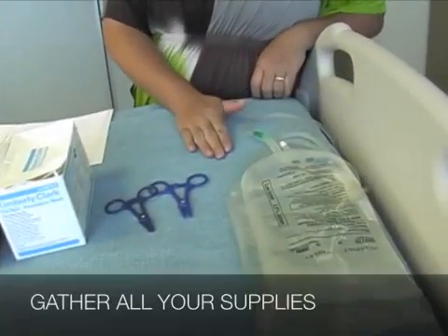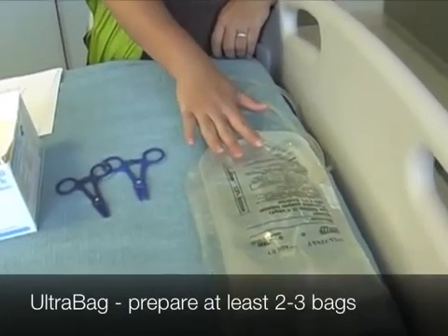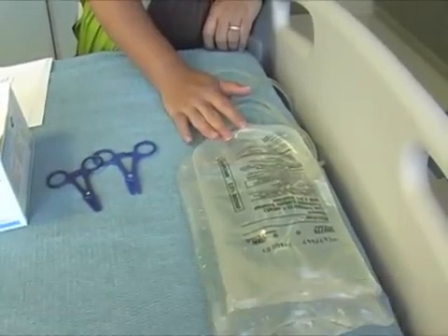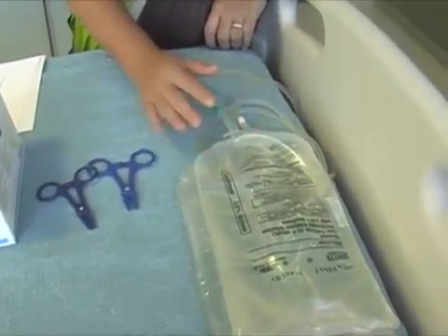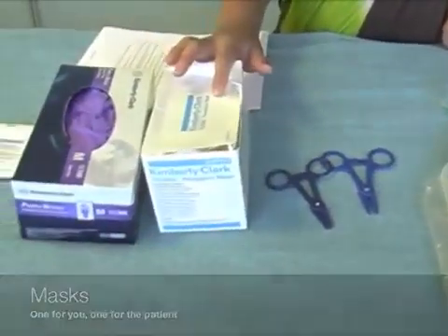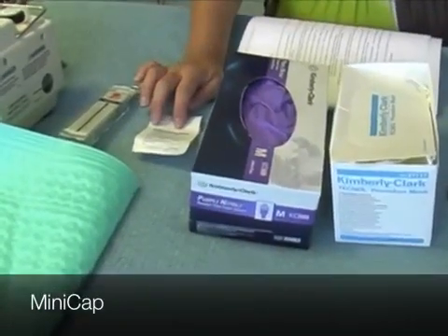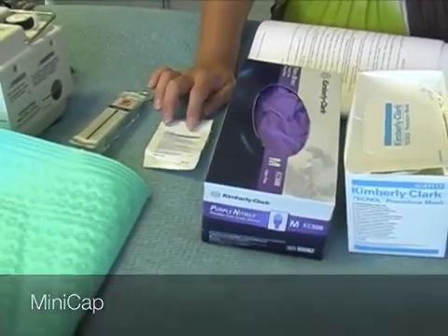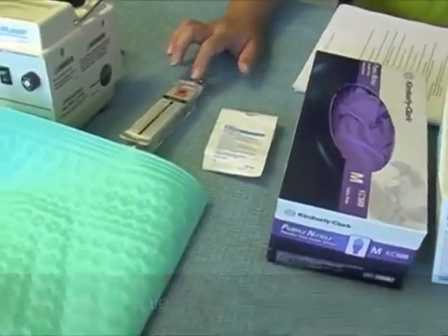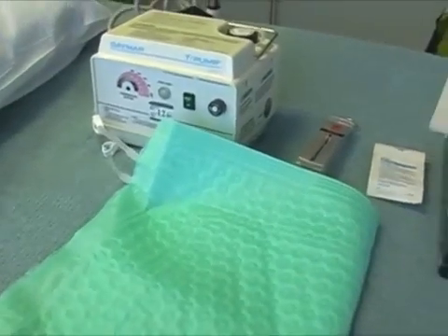Okay, now the next step is to gather the supplies. You're going to have the ultra bag, and you would want to gather at least two or three bags so that you'll be ahead of your game. You're going to have 2 of the clamps, then you'll have your mask and your gloves, and your disconnect caps, which is also known as the mini cap with iodine solution in it. And then you'll have your weighing scale, your heating pad, and finally your IV pole.